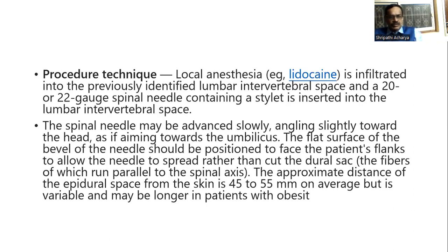Procedure of the lumbar puncture, procedure technique. Local anesthesia with lidocaine is injected into the previously identified lumbar intervertebral space, and a 20 or 22 gauge spinal needle containing a stylet is inserted into the lumbar intervertebral space.